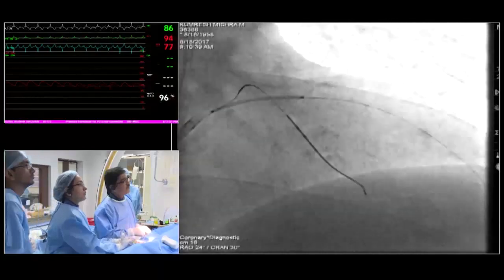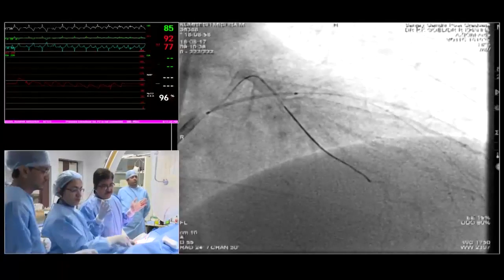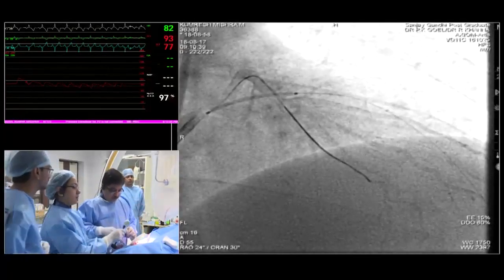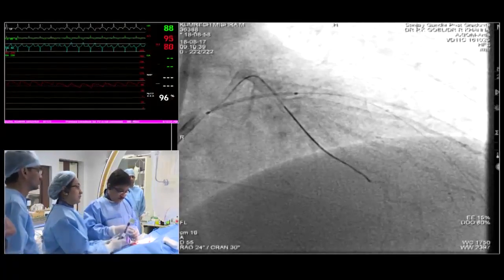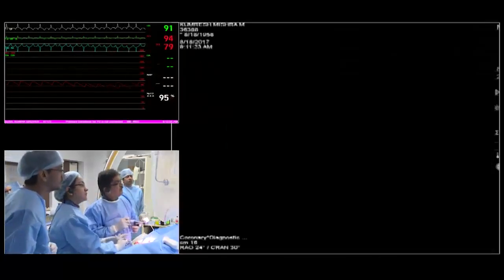Test, please. So it's going well beyond the normal part. 20 is also long. The proximal portion of the stent, everything is covered. Yeah. You need to see in different angles. Can we see LAO cranial? Let me see. Yes.